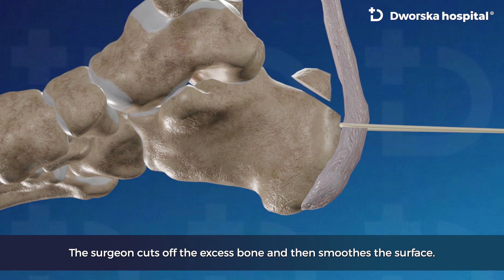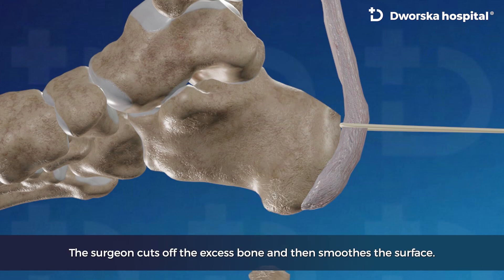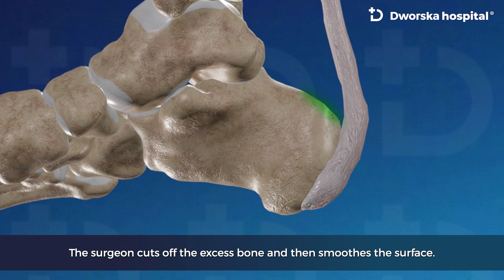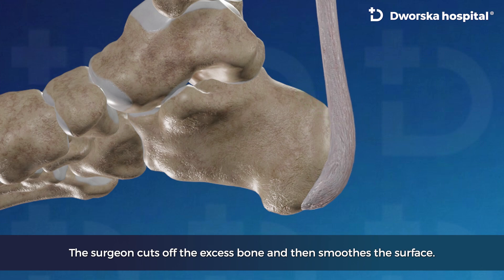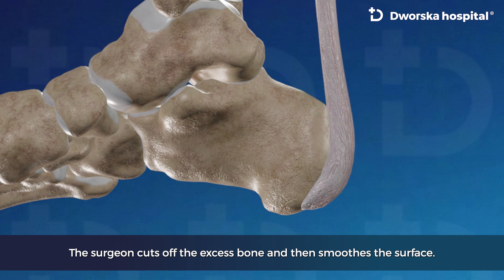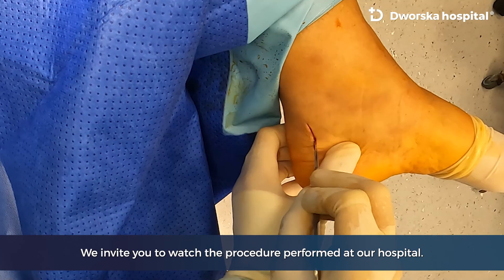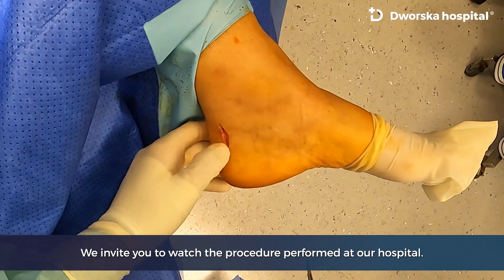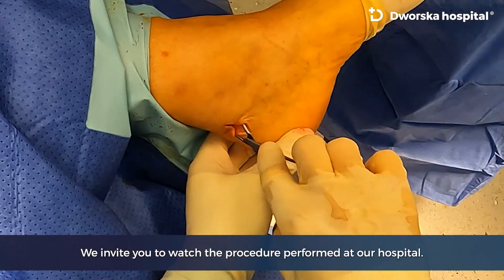The surgeon cuts off the excess bone and then smooths the surface. We invite you to watch the procedure performed at our hospital.